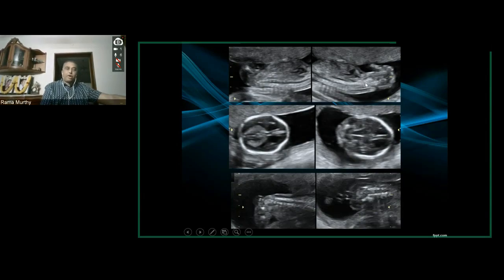And what actually brought this to my notice was the cranium. When I look at the cranium, there's a classical frontoparietal flattening, the lemon sign. And when you get into the occipital region, transcerebellar, you find the classical sausage-shaped cerebellum, the banana sign. Now that is enough clue for you to get back to your spine and very, very assiduously wait.